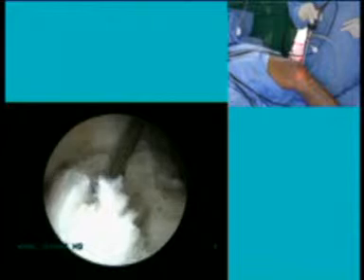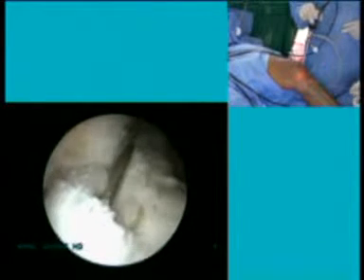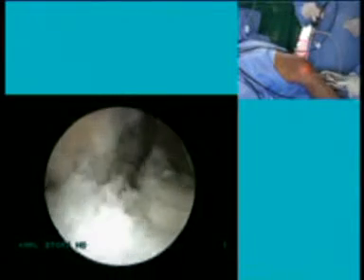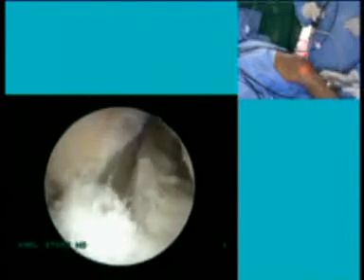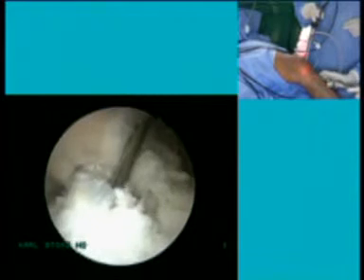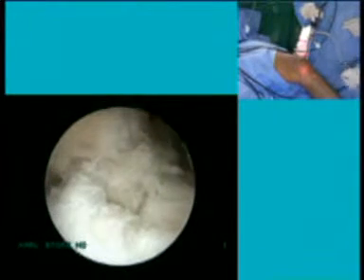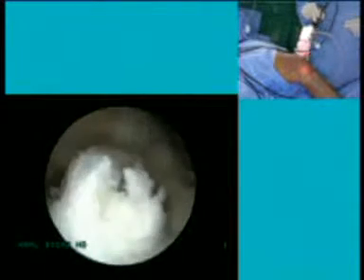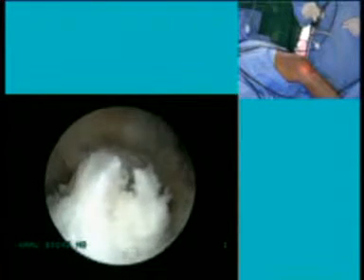Because you see, a little bit of confluence doesn't matter, but if they are too close, then probably it matters. Then it becomes a vague single bundle rather than actually the double bundle. So, a little bit, 1 mm. Okay, then a knife, please, and a hook. Your whole footprint. Then only the purpose is being served.